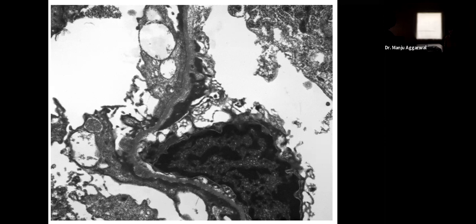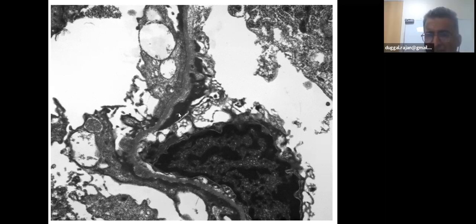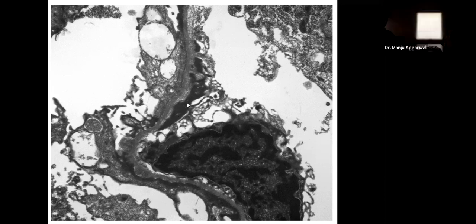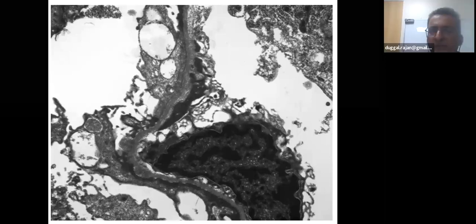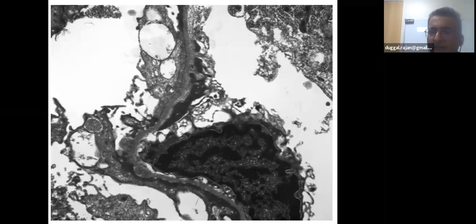There's something on the endothelial surface also. So, ma'am, when you look at this side, there are some dark color things. Ma'am, many times these are artifacts. But if it is not an artifact, that can happen with fibrin. Fibrin can also produce this kind of dark color structures.